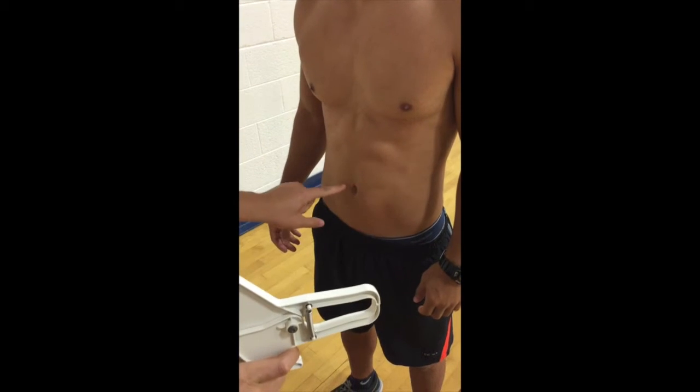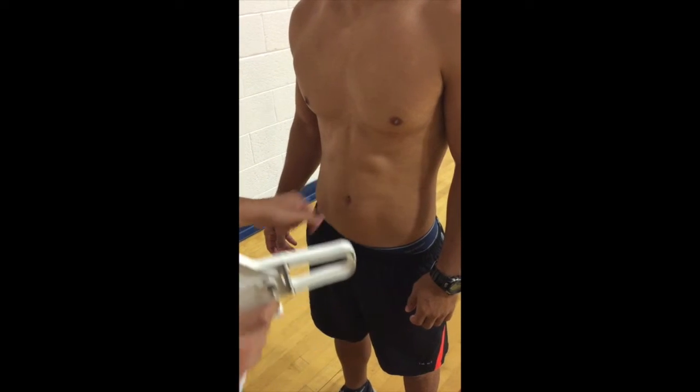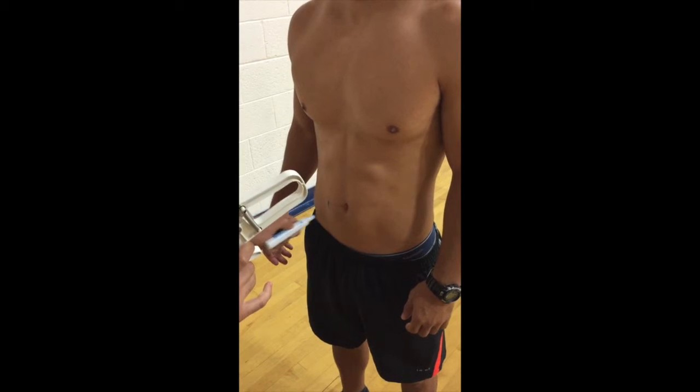The abdominal skin fold is a vertical fold 2 centimeters to the right of the umbilicus.